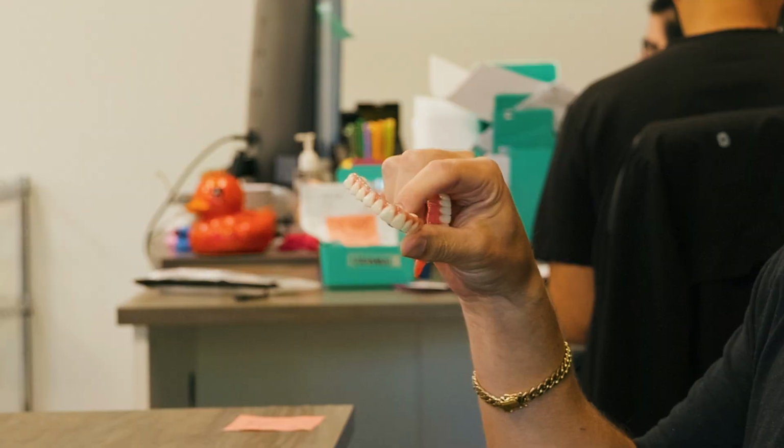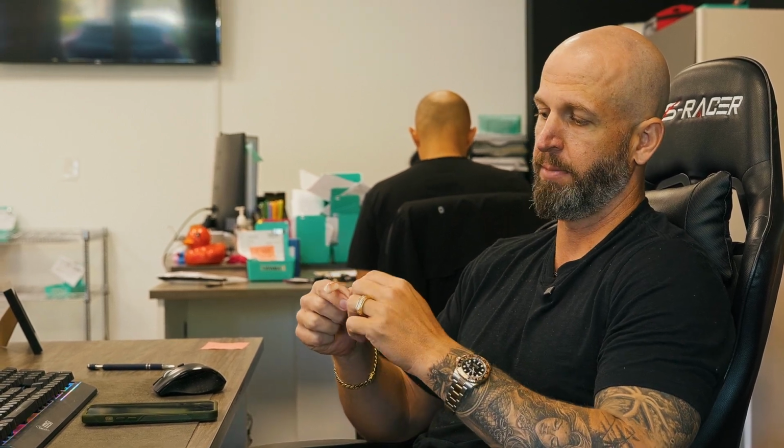We have surgery coming in a couple weeks. Rather than create this denture for the upper and then have to pick up all the implants at once, now I've got a stable foundation. 2 screws will engage, and we can index and place 3, 4 more implants and then pick these up. The reason why we're doing it this way is because the oral surgeon and the general dentist don't have any 3D printing technology. They don't have a photogrammetry unit. So this is a quick and convenient way, a little bit of mix of digital and analog in an immediate load process.